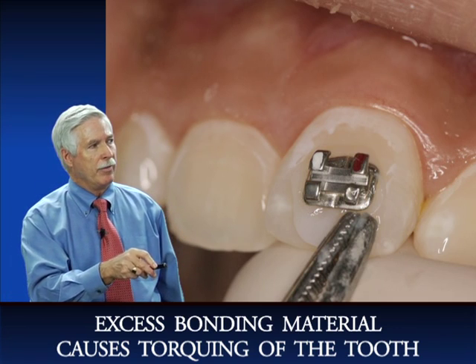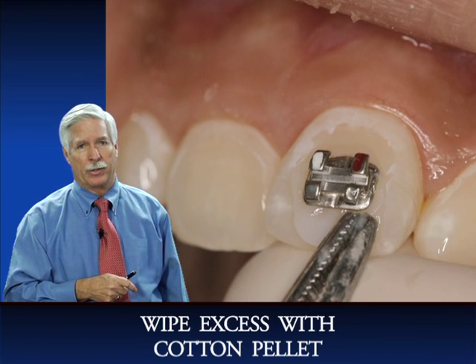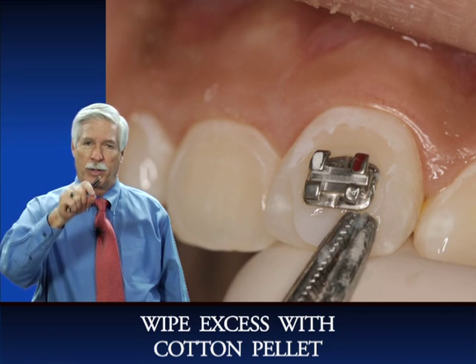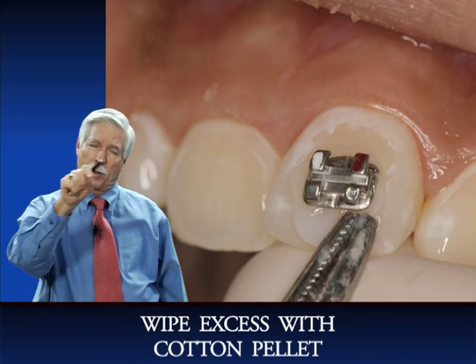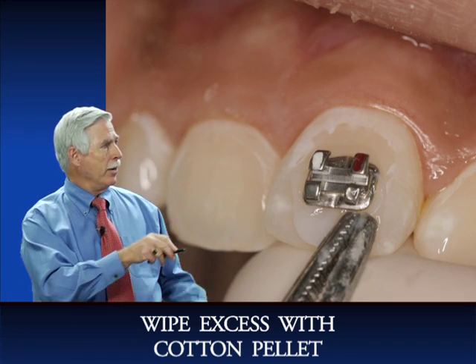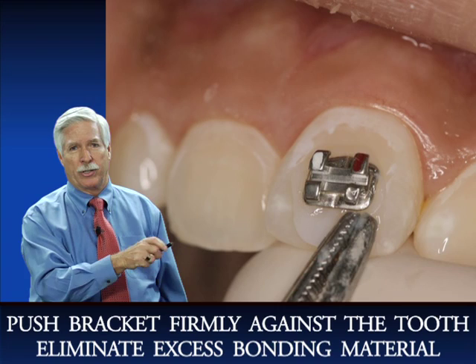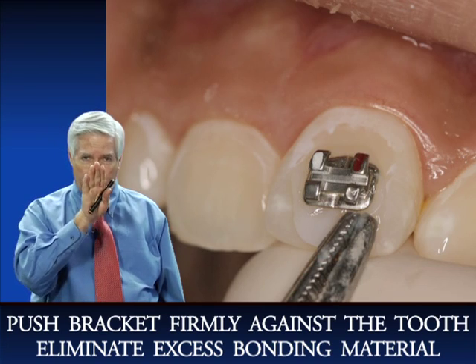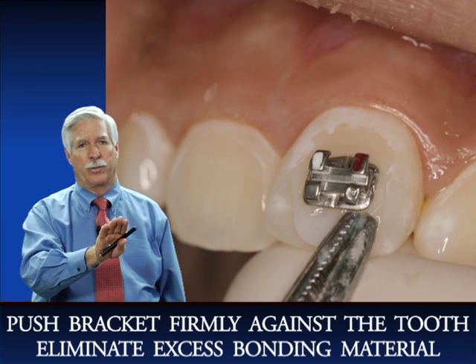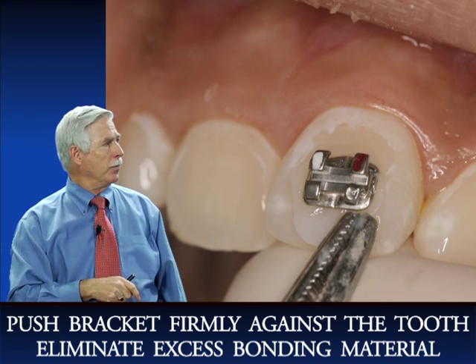Here we're wiping off the excess bonding material with our cotton pliers. You could also go in there with a cotton pellet and wipe it off, whatever you want to use. But remember, you've placed that hard against the tooth. You can't just put it on there. You've got to push it hard against the tooth in order for it to stay on and for the bonding to be the most successful.